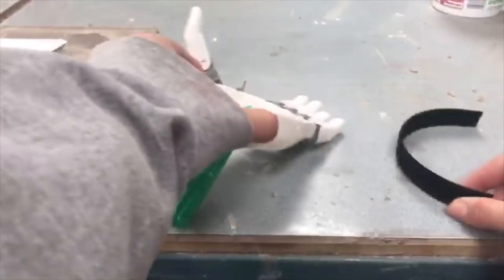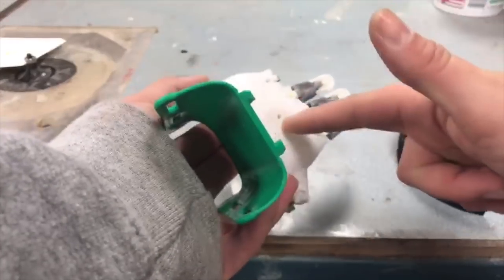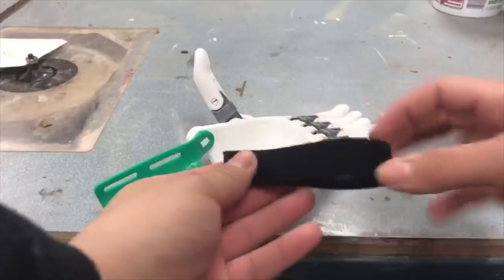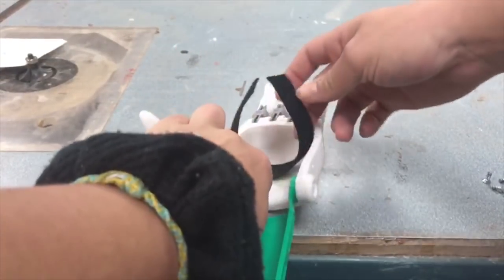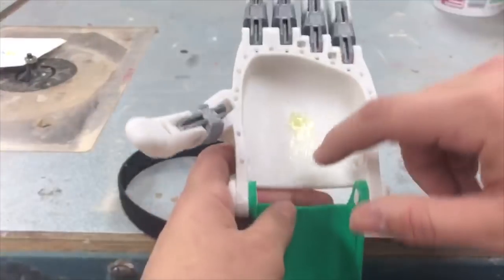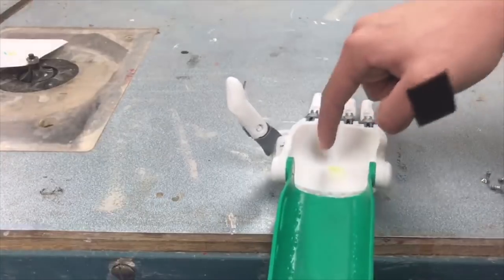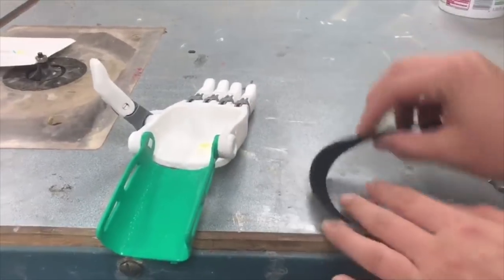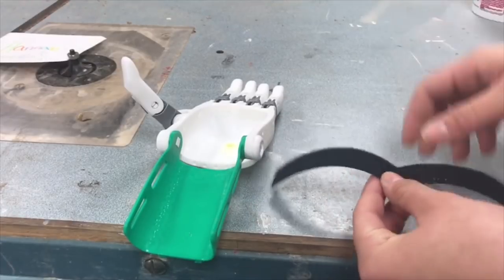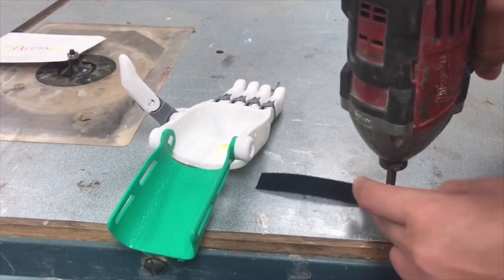Once we have all these screws flattened out and shortened — because they're too long and would poke through the other side — we just have a piece of velcro. When I measure this I fold it in half, put it in here and mark the middle so I can measure how much will be used. I put some epoxy in this hole so that we can drill the screw into it instead of going straight through. Before we drill the screw into here we need to put the screw through the velcro first. Fold it in half, make a crease, and make sure the soft part is up because that's the part the skin will be on.